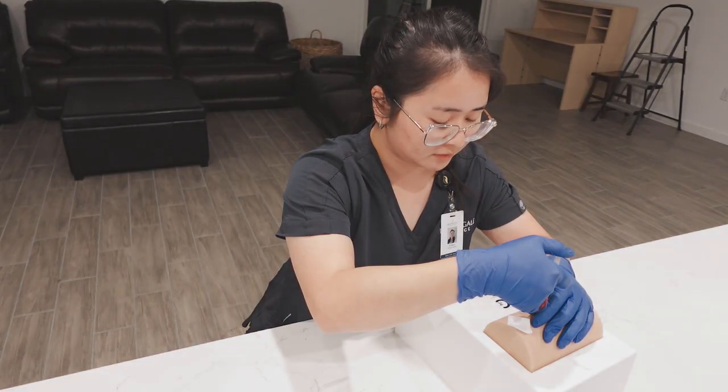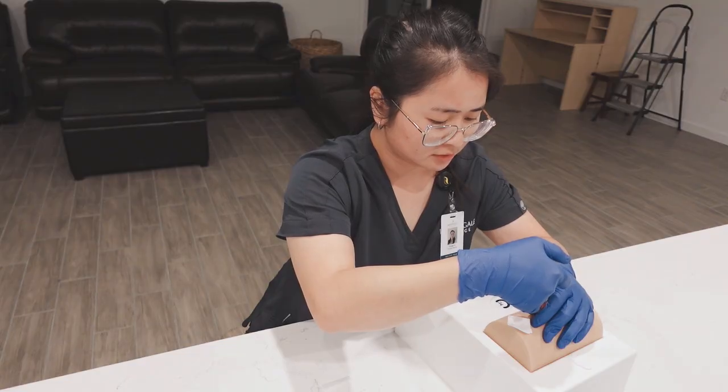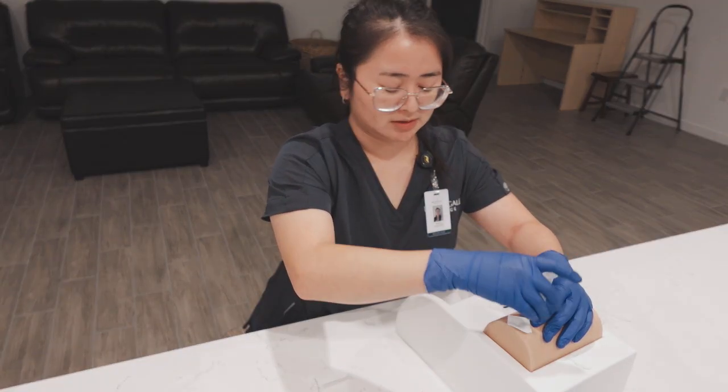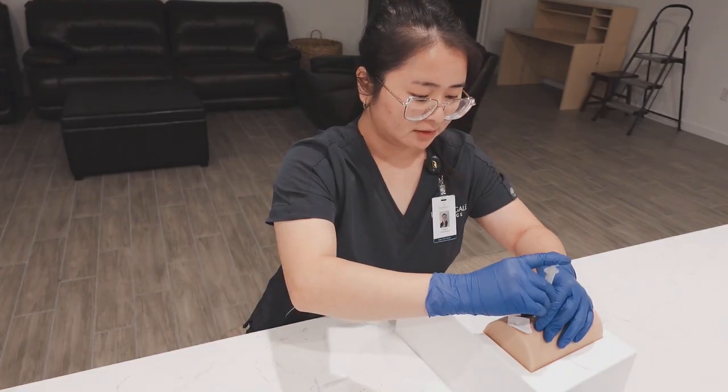the liquid. And the liquid must be injected 10 seconds per milliliter. So, very slowly, very gently. All right. Okay. Now we're going to wait for 10 seconds. 1, 2, 3, 4, 5, 6, 7, 8, 9, 10. And then I'm going to lift up.